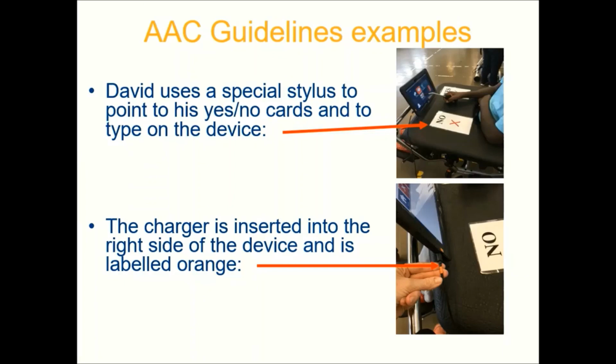And we also just put in there about how to charge a device. That's more for high-tech devices, obviously. But for low-tech, maybe you can just say, the communication book is kept in their tray at the end of the day, or so-and-so takes their communication book home with them every day on the bus. Please make sure it's in their bag. Whatever the support staff need to know, make sure it's really clear, really simple, and with photographs if possible.